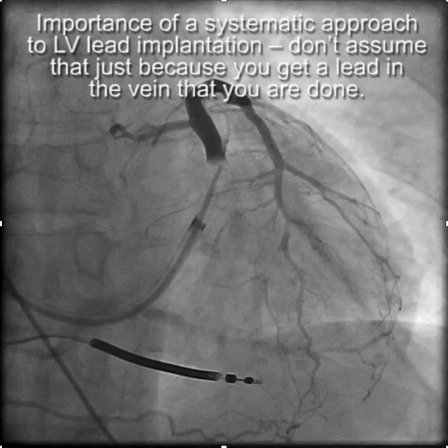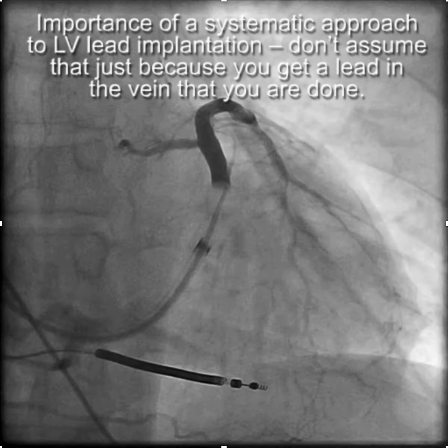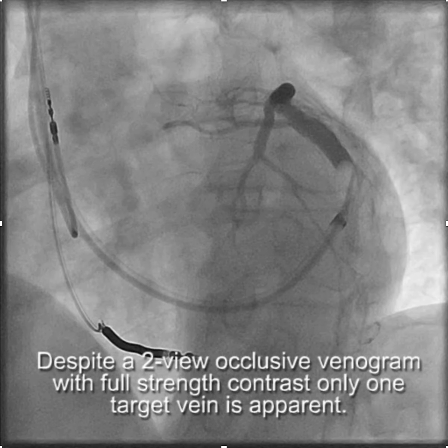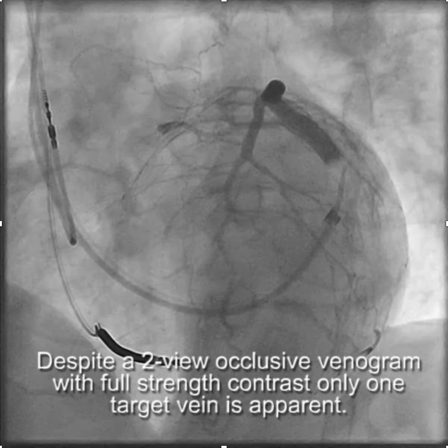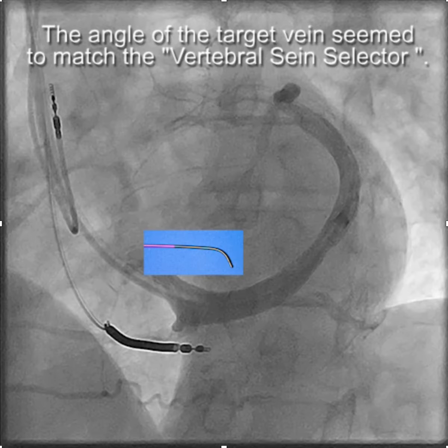This video demonstrates the importance of a systematic approach to LV lead implantation. You don't want to assume that just because you got the lead in the vein that your implant is complete. Despite two-view occlusive CS venograms with full-strength contrast, there was really only one target vein that was apparent.